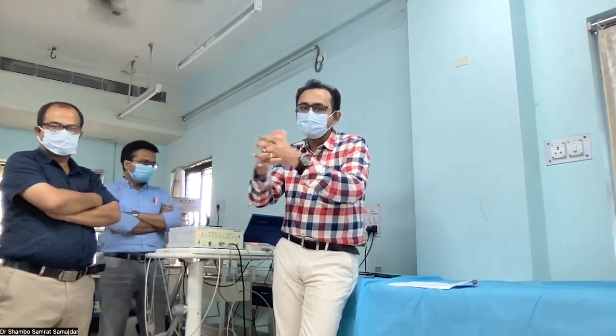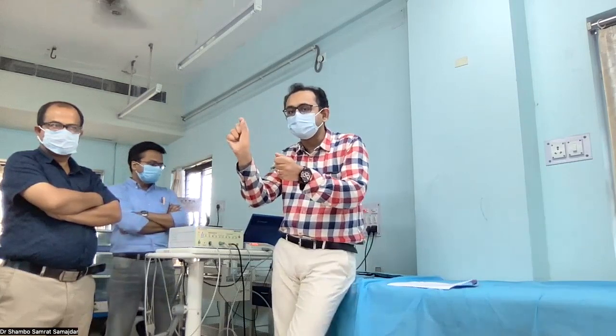We can use a BP machine, that is an aneroid BP machine. If we open that part and give one blow into the BP machine after squeezing the cuff, we can see how the pressure elevates to 40 millimeters of mercury. So we have to blow with a pressure of 40 millimeters of mercury, so that the Valsalva maneuver can be done in a standardized process.